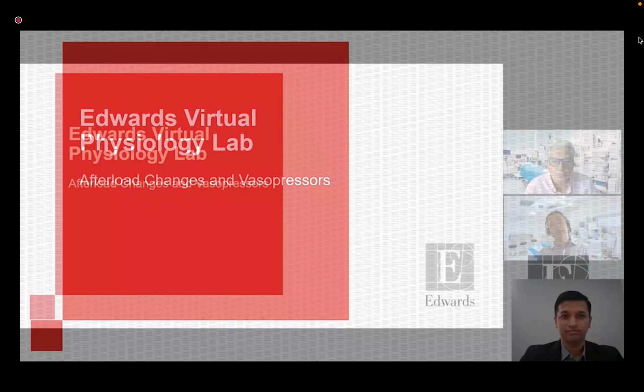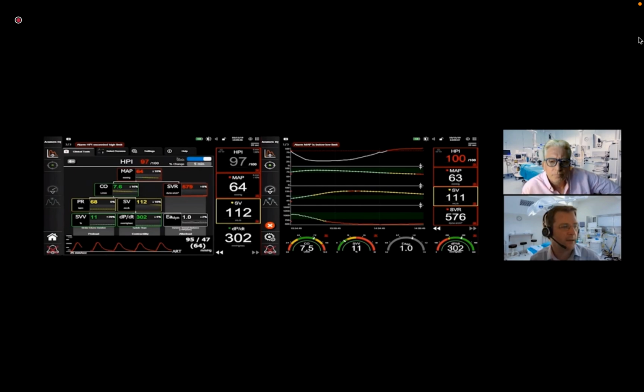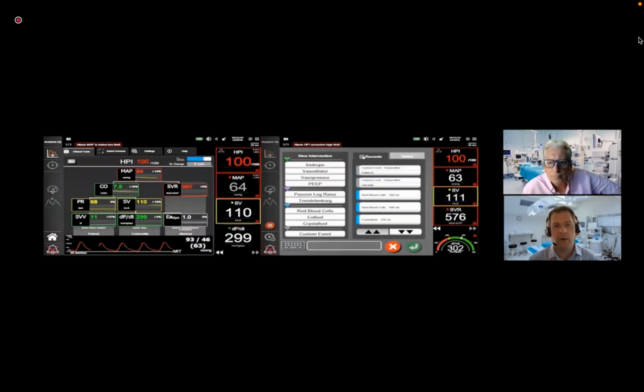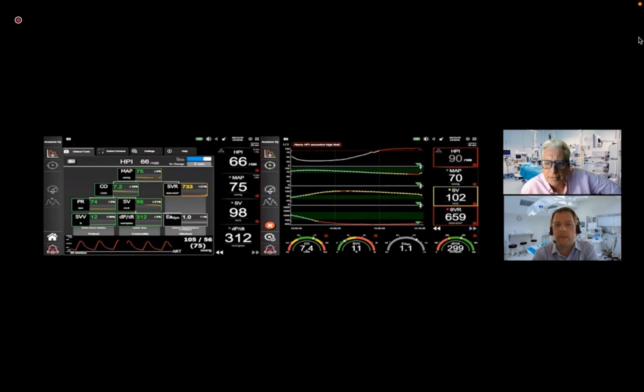So in this final part of our virtual physiology lab, we're looking at the effects of vasopressors. I think we touched on vasopressors and their potential dangers in the first part of the lab, but they do have appropriate use at the appropriate time. We can look at our simulation here to see the effects of a vasopressor in terms of HPI and our other hemodynamic parameters. Now, Monty, this is a phenylephrine bolus or infusion that we're giving, is that correct? It is. It's a straightforward piece of alpha agonism. So therefore, predominantly SVR, we believe, we're affecting by giving this particular drug at the moment. The systemic vascular resistance.